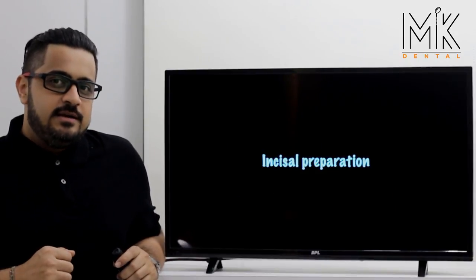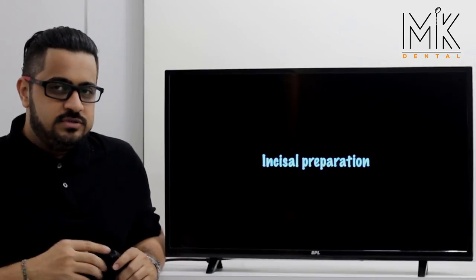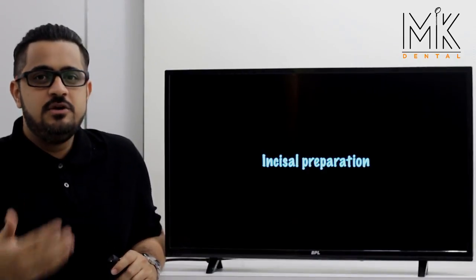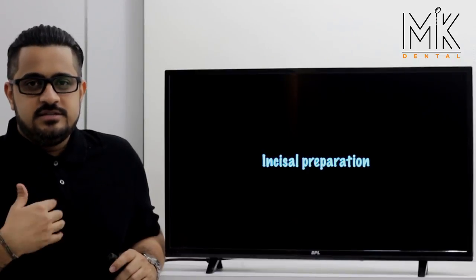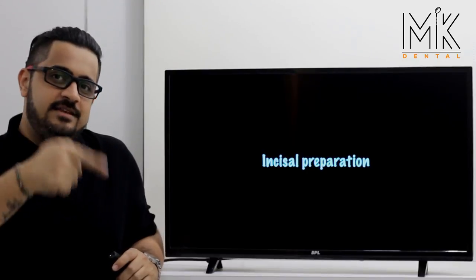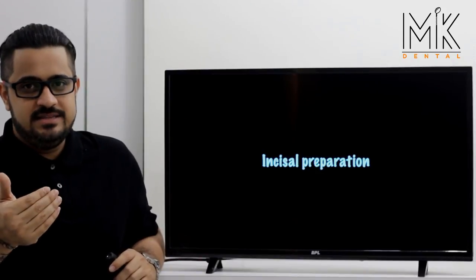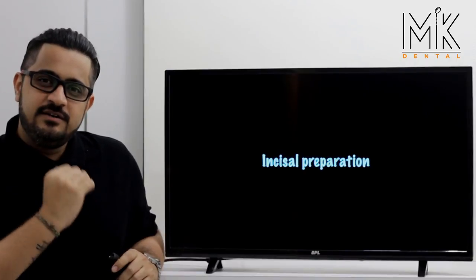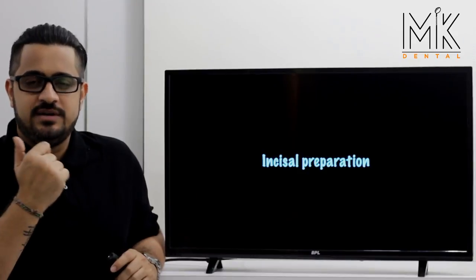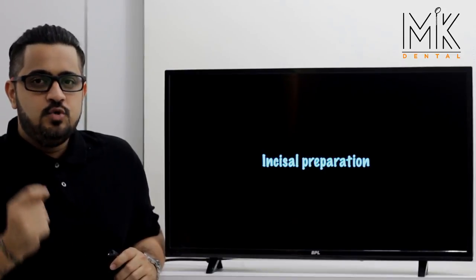Once you're through with this, you next reduce the incisal aspect of the preparation. As noted in previous videos, the incisal edge requires two millimeters of reduction. The old method — making three grooves one millimeter deep, connecting them, then three more one millimeter deep grooves — inevitably results in under-reducing the incisal edge. This area may then become an interference, especially in protrusive movements, causing the incisal edge of crowns to fracture or cause wear.